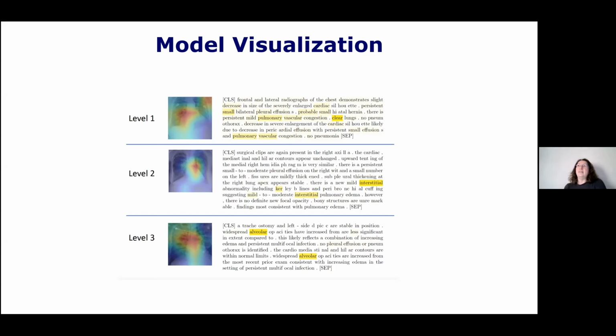So this approach to figuring out what the model is doing is extremely useful if you're trying to figure out where the object is in the image that affected the decision. But it's not that useful if you're trying to figure out what the difference in texture was in that part of the image. And so we've been toying with ideas of how to capture these differences.